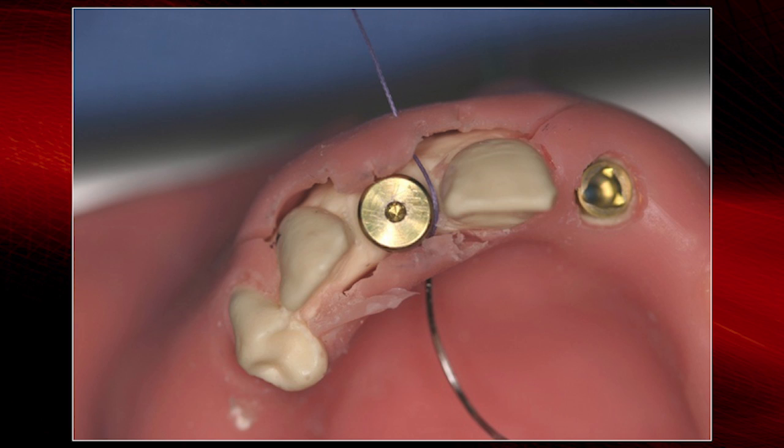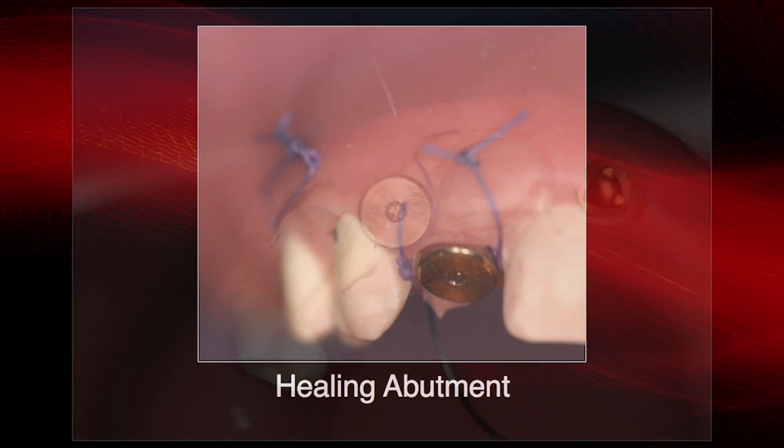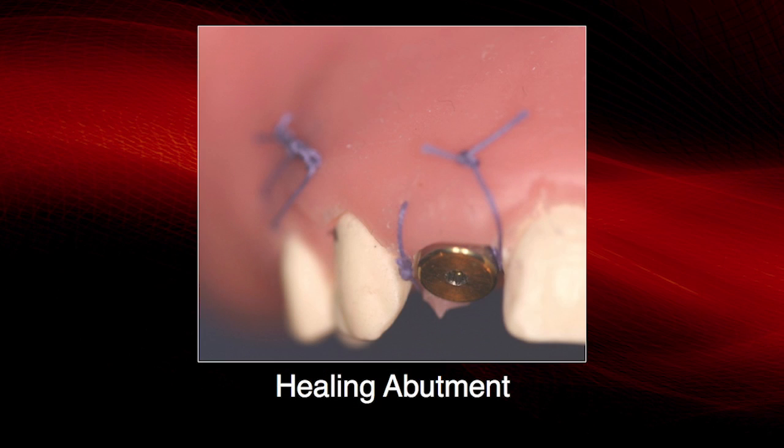So when you put on a healing abutment at that point, you're not going to get complete closure. So we want to keep that tissue to the facial. Now, there is going to be a space in here. What happens to that space is the buccal tissue, the labial tissue, grows and meets the lingual tissue as that grows. So they grow to each other, and that creates papilla. So you see the healing abutment.